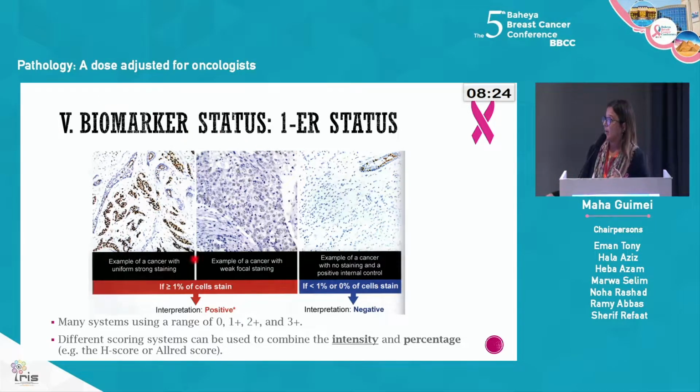فعندنا على الشمال خالص ال completely positive، اللي هو ER positive مليان، وفي طرق كتيرة لل evaluation of the ER positivity، whether بنقول +1 +2 +3 أو بنستخدم ال Allred scoring أو ال H scoring. كلها different scoring systems بتقول لي هو قد إيه في ER positivity، أو إن ما عنديش خالص، less than 1%، وده اللي بعتبره negative. الليتست WHO بتقول إن في category في النص اسمها low positive ER. اللو positive ER ده معناه إن السيلز expressing the ER are only من 1 ل 10%، فدي بنسميها low positive.